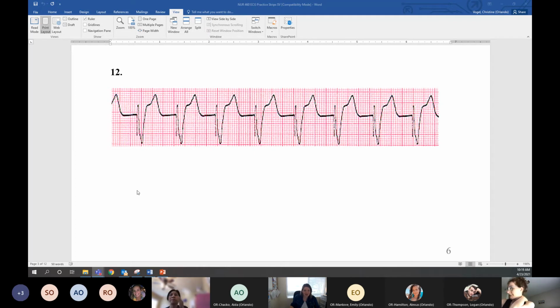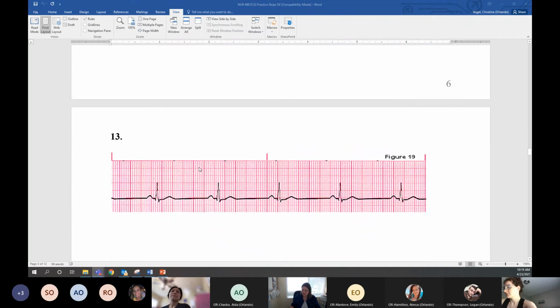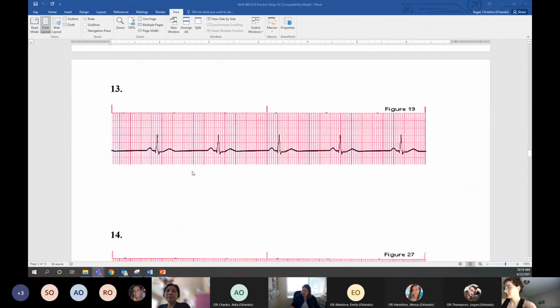Sometimes you might see a spike and then there's nothing after it and there's no capture there, and they might need some adjustments to their, like the voltage or amps, okay? So there needs to be adjustments sometimes with pacing. All right, another, it is what it is.